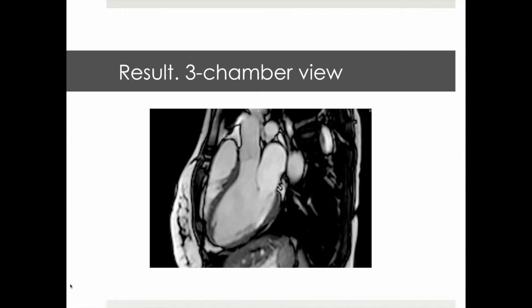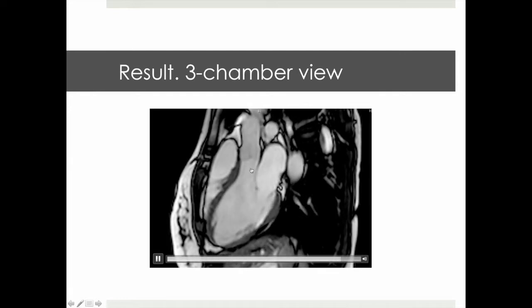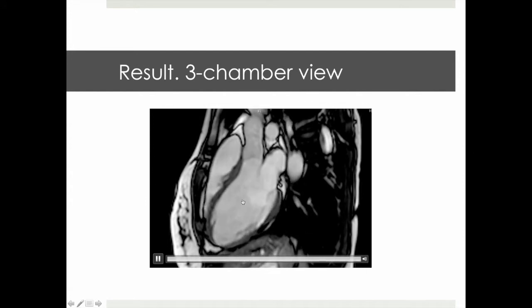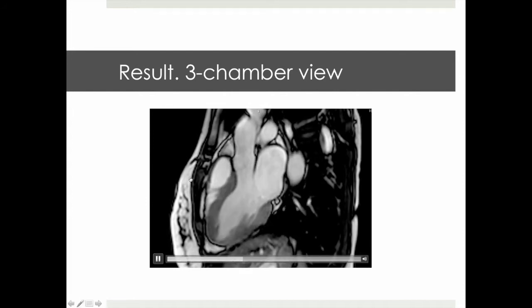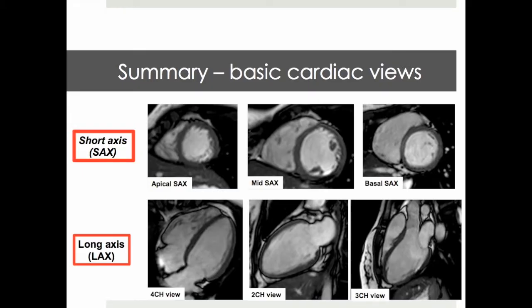And here comes our 3-chamber view, allowing visualization of aortic valve and ascending aorta, LVOT, mitral valve, as well as left atrium, left ventricle, and assessment of regional wall motion abnormalities in anterior septum, as well as inferolateral wall.